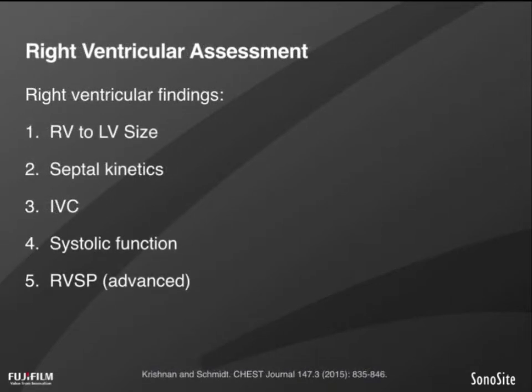Let's move on to the right ventricle now. Now, the right ventricle has often suffered a less glamorous existence than the left ventricle. However, we now understand just how important right ventricular function is and how much it can influence clinical trajectory and outcomes for patients. Rather than being a simple assessment of squeeze, which the left ventricle offers, the right ventricle offers a few separate findings that you must piece together to support or refute the notion that the right ventricle is impaired.